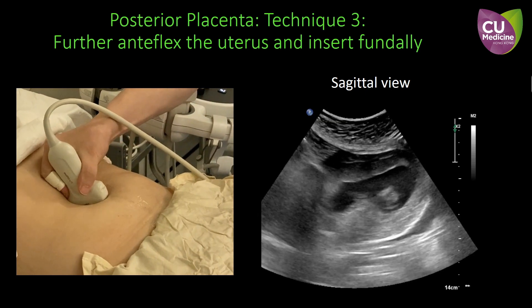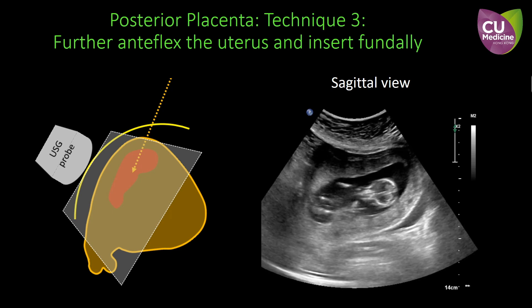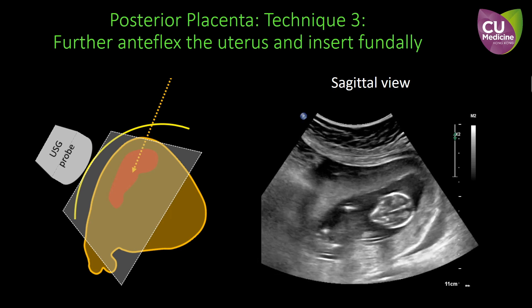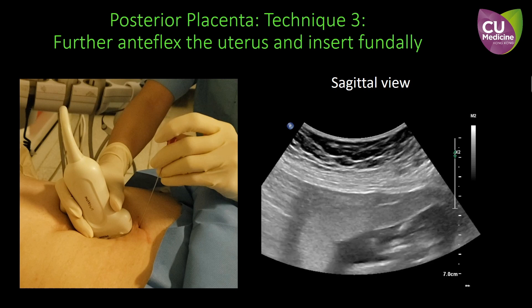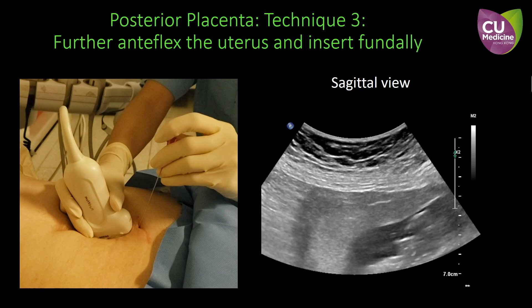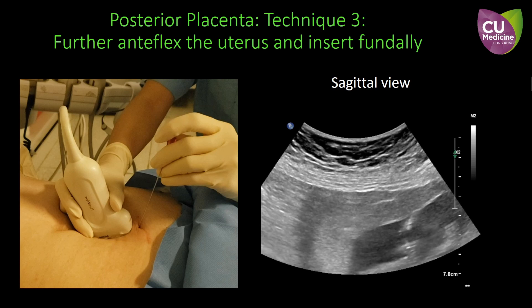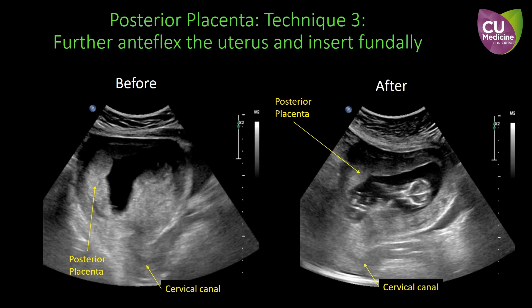Here shows the changes of the ultrasound images after relocating the ultrasound probe to the back of the uterus. Continuous firm pressure is required to maintain the position of the uterus. The posterior placenta is then under the abdominal wall and is accessible for CVS. To insert the needle in this direction, care must be taken to not overshoot the posterior uterine wall. These two images compare the orientation of the uterus and the placenta before and after further antiflexion of the uterus. You can also observe the change in the utero-cervical angle.